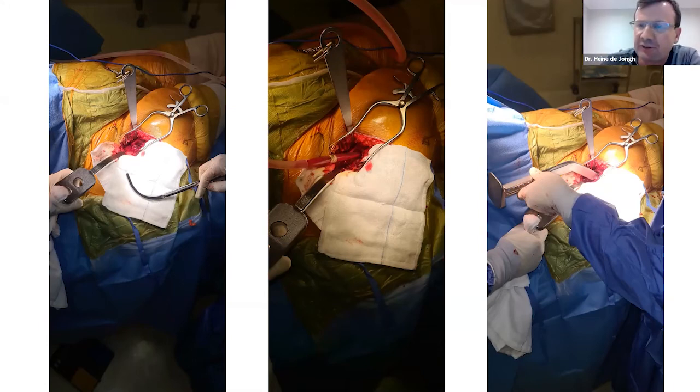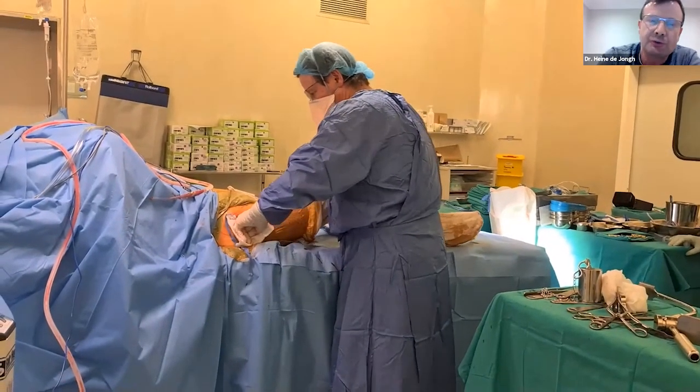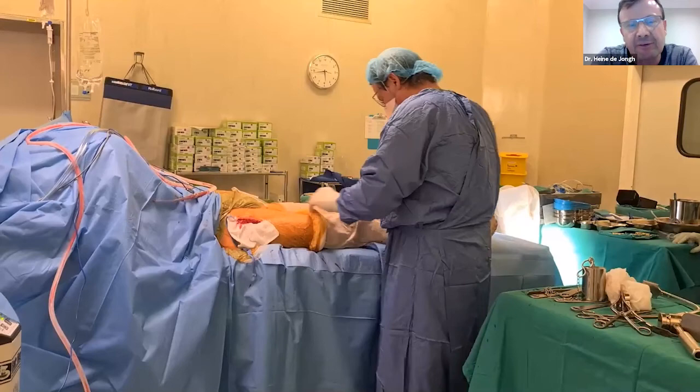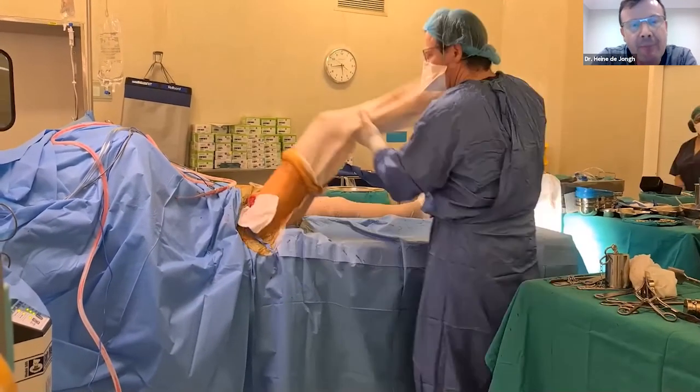But I find it very easy with the leg lying in front of me. I know where the knee is, and I can see the leg so that I can aim. I'm very comfortable and can safely determine the anteversion on the femur and have a clear view of the medial calcar. So, but I suppose this is the key to, well, the thing that I like about this technique the most is the stability testing.